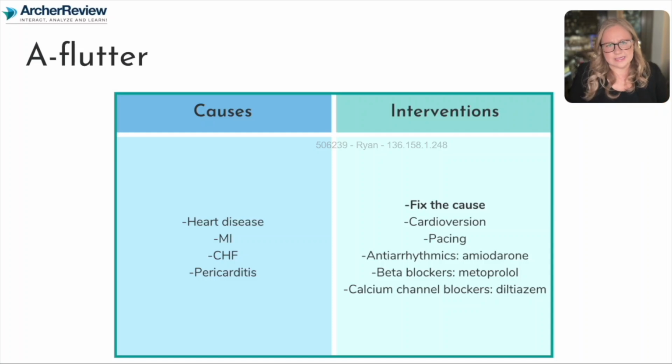We talked about pacing and how you have to send electricity out for the body. So when that heart is maybe in a heart block or bradycardia and it's not sending appropriate electrical activities, we do it for the heart. Well, cardioversion is an attempt to reset the heart to get it out of that dysrhythmia and start that electricity going back through the normal pathway. We use cardioversion when the client has a pulse. We want to synchronize us sending electricity through the heart with what the client already has going on.